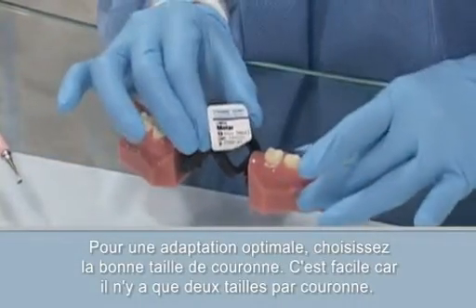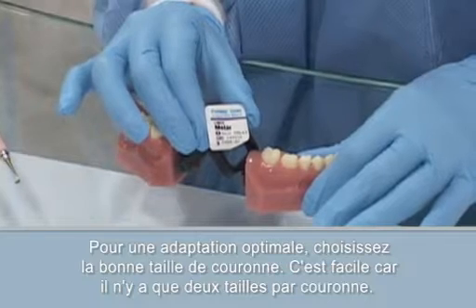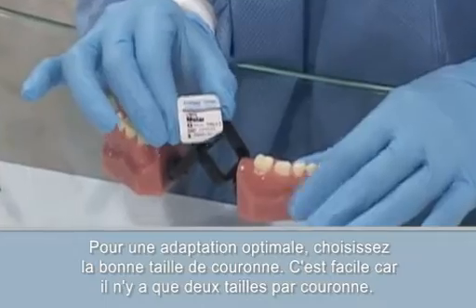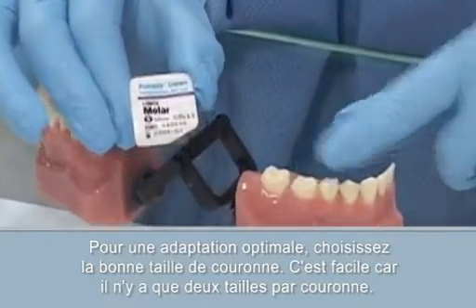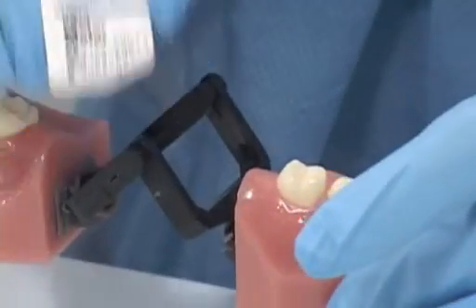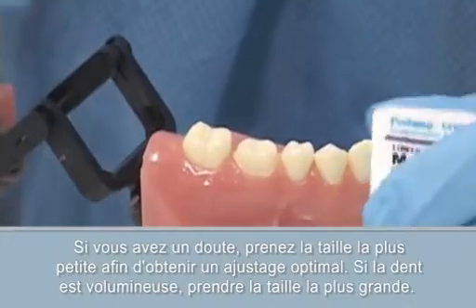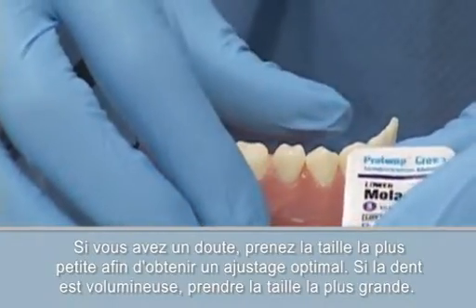So it makes it really easy for the assistant or the dentist to choose what they're going to use. It's very entry level. Of course it's going to be a molar, but one of the things I want them to look at is I always start with the small first. If I've got a larger crown that I'm going to be using, I really want to make sure that this tooth is a lot bigger in size.